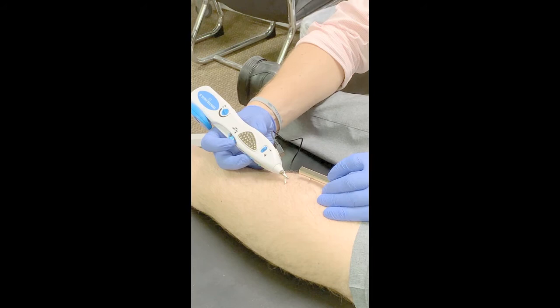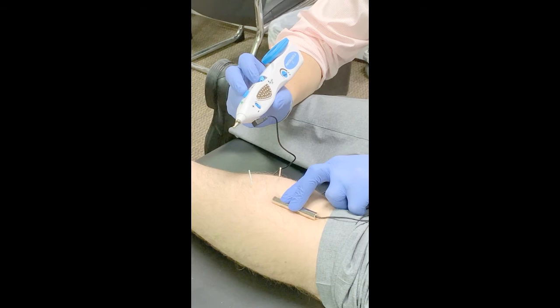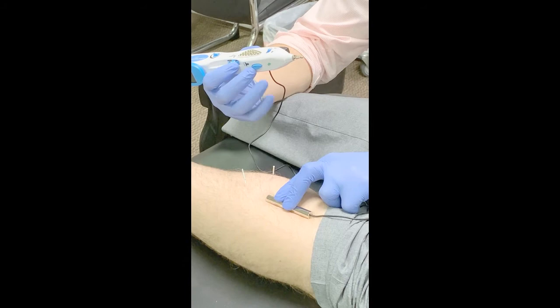Probably the biggest confusion is if I only have one indwelling needle — that requires me to somehow ground that bar on the patient. So here I'll just give a firm compression. I would recommend grounding on soft tissue, so not a bony prominence.